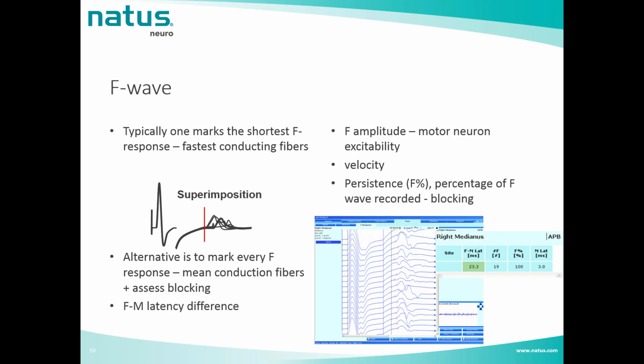When we have a healthy patient or an easy patient, we can stimulate 7 to 10 times. For more difficult patients, one may need to stimulate more, from 10 to 15 times. The calculation of the persistence only starts to be reliable once we have 10 stimulations. So for a patient with 7 stimulations, the persistence may not be taken as valuable data recorded.